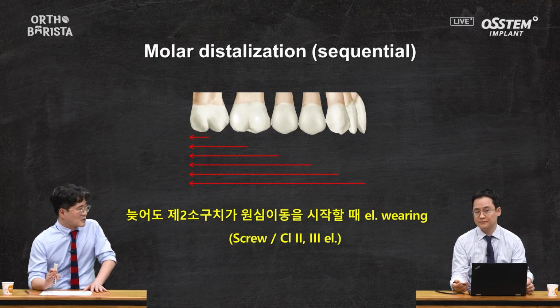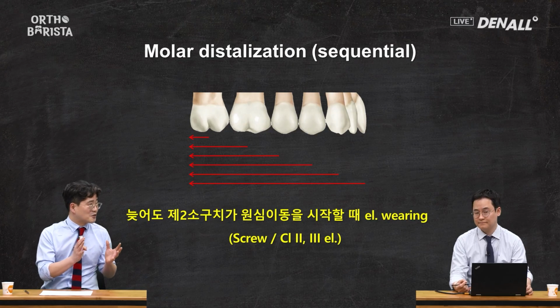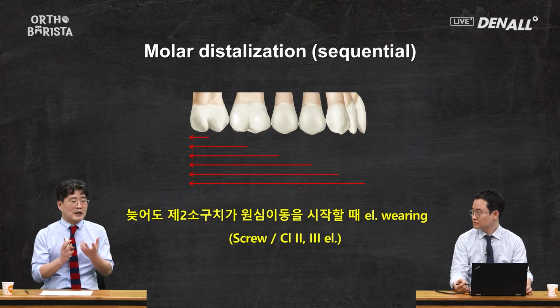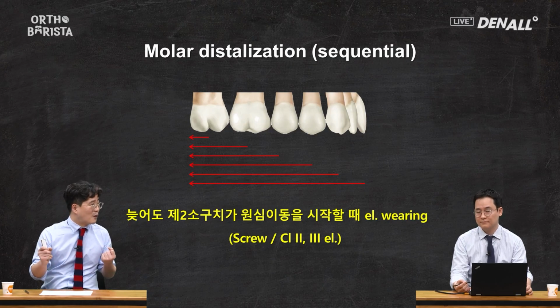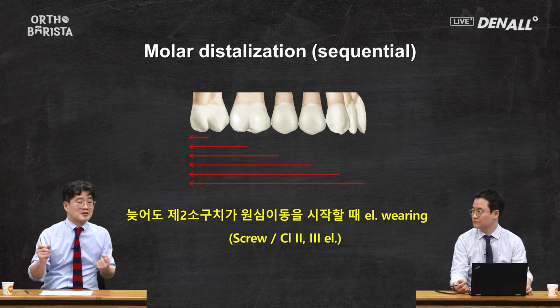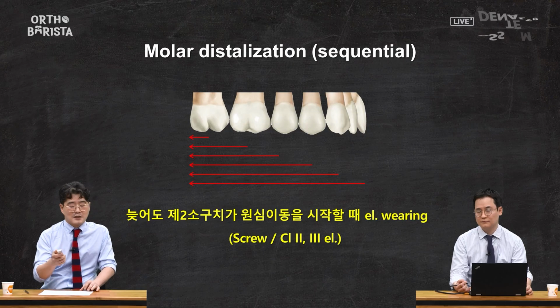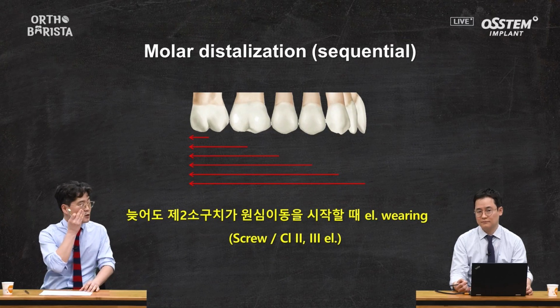Another critical consideration is the principle of action and reaction, which also applies to clear aligners. As the molars move distally, there is often a reactive force on the anterior region, causing a tendency for it to protrude. To counteract this, elastics or screws can be utilized, and we will provide a brief explanation using a case example.